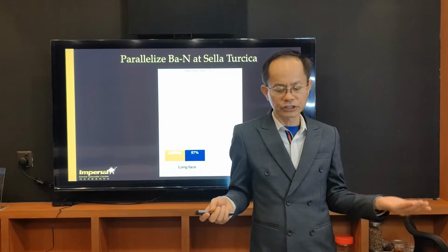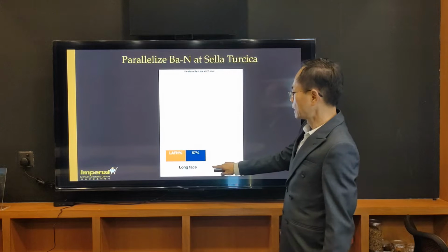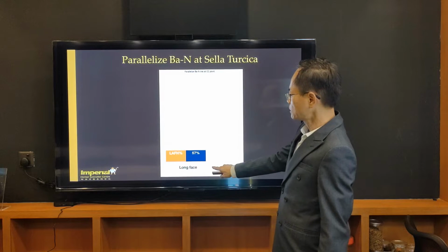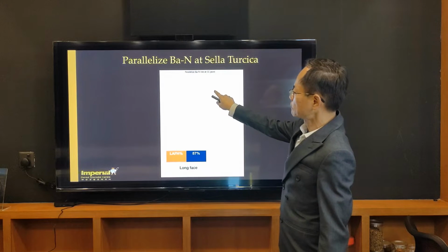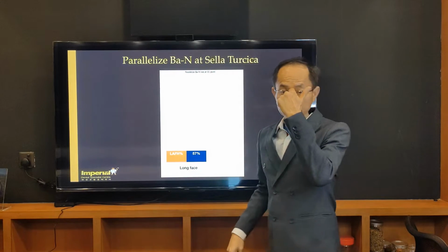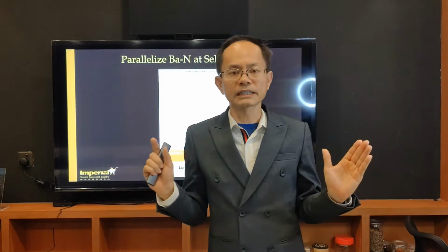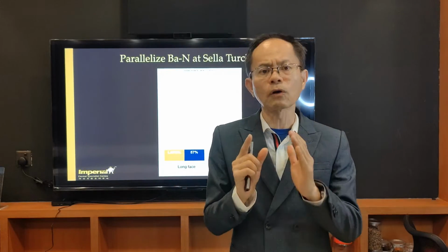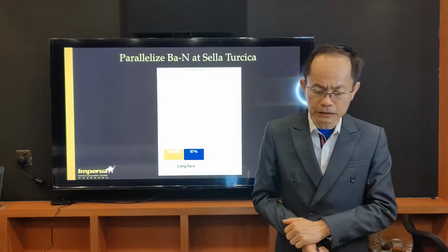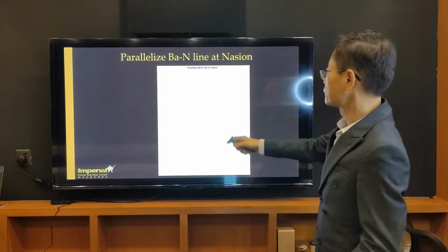We measure from the chin point, which we call the menton, to the maxilla, and then to the nasion, which is our forehead. A normal proportion should be 55%, but in this case it's 57%, which means it's a jaw-based problem. The reason for this jaw-based problem we have to check further.